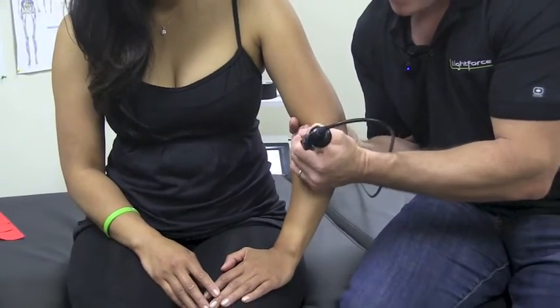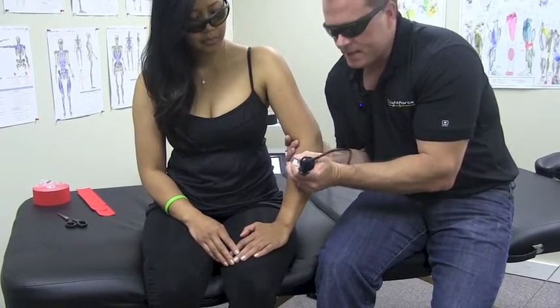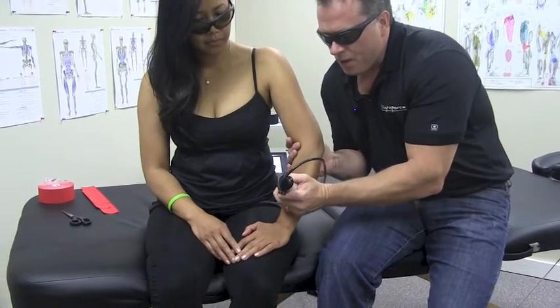Then I'll stop, move the massage ball head around a little bit, and release some of the trigger points, knots, or adhesions that I feel in there, and then go all the way down.